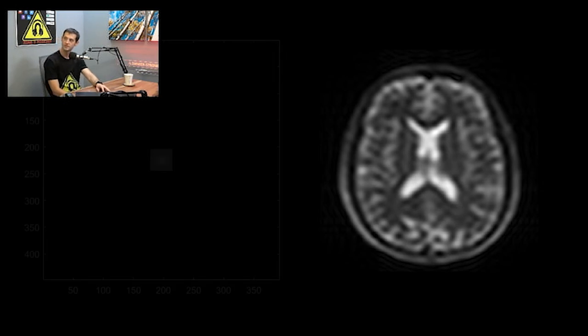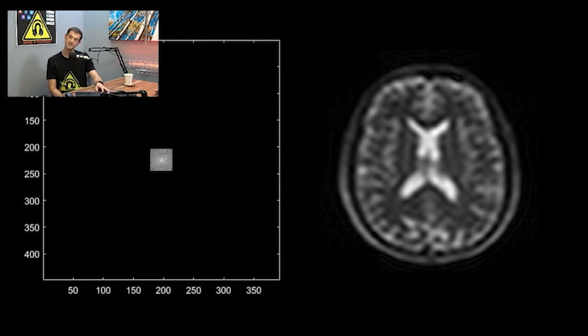David, show this. So now what I did is I threw away all the Kspace information outside of the center. So the rest of the starburst is gone. All you get is the center part. And this is an illustration of like the center of Kspace is your low frequencies. It also determines the contrast in the image. So, I mean, you can tell it's a brain. If you force someone, they might say it's T2 because it's got that bright fluid. And so that information, the general shape of it and the contrast, is determined by the center of Kspace.